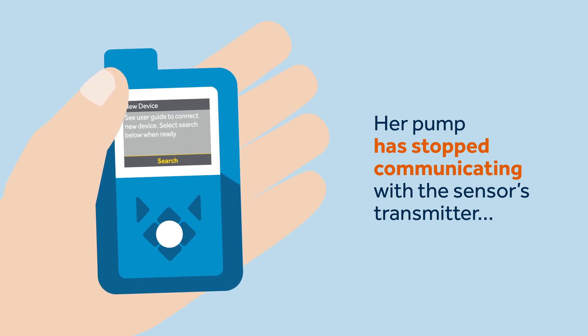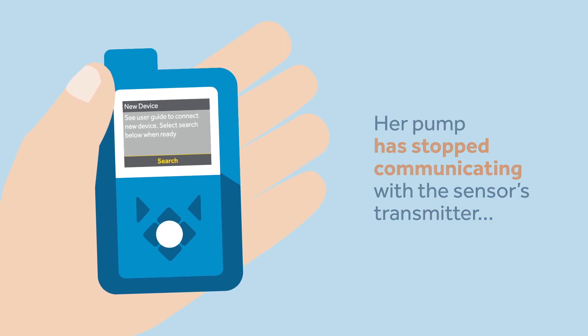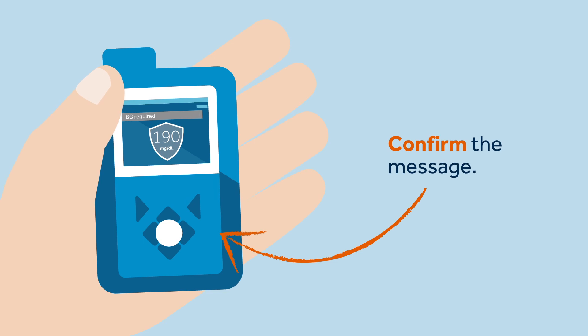For example, the sensor isn't providing a glucose value because her pump has stopped communicating with the sensor's transmitter. Sophie reads the text on the pump and confirms the message.